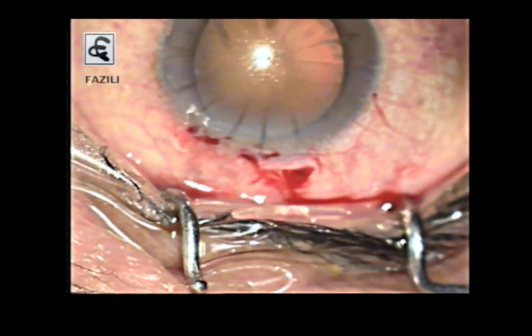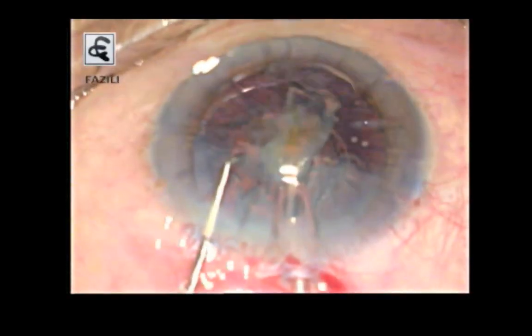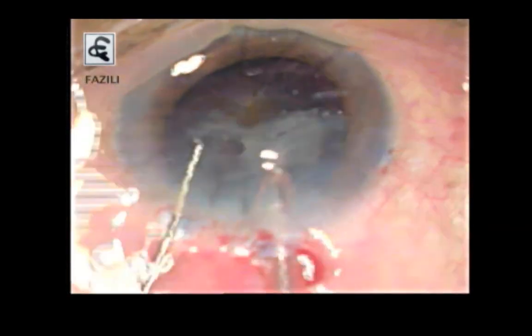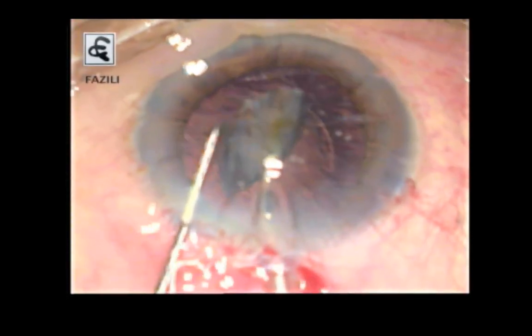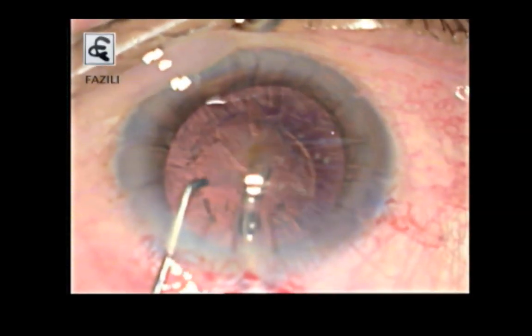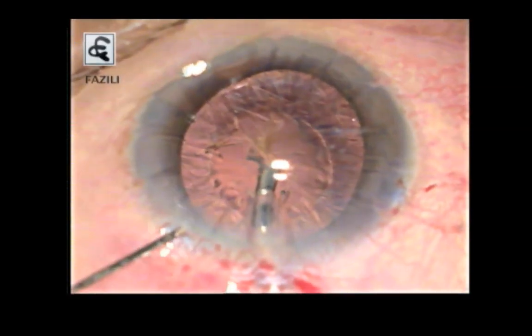The side port incision has to be in between the corneal incisions which have been created, the keratotomies which have been created. Again, you can see here the cataract surgery will progress almost the same as any other myope or a high myope. So you have to take the same amount of precautions, and those precautions which I have already demonstrated to you vis-a-vis chamber fluctuation.